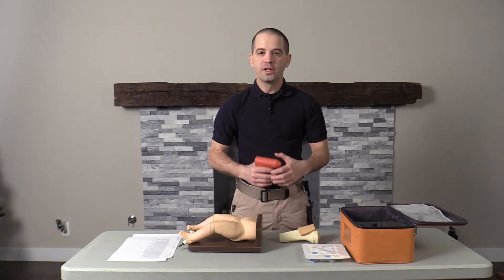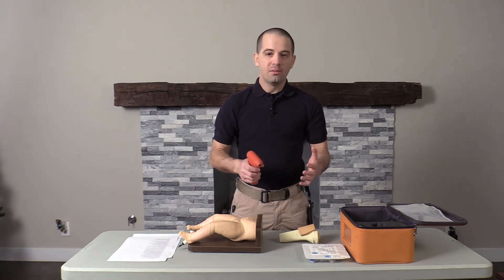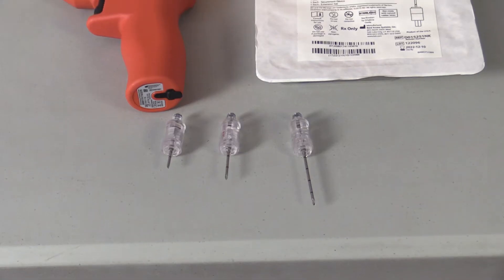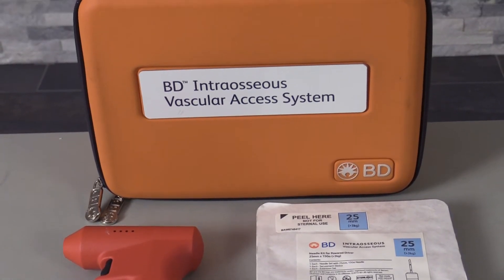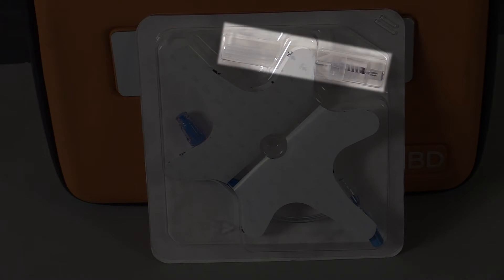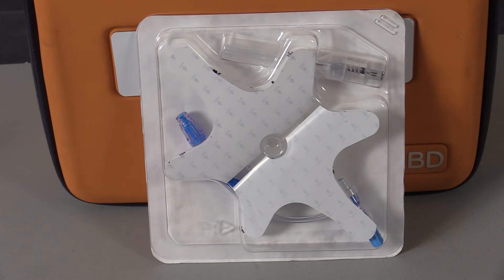Now let's talk about how it performs. Just like all the other drivers in the I.O. market, you're going to have to figure out your needle length. This comes with three different needles, just like the other drivers — you've got your infant, your adult, and your humeral head needle. You will notice that all the needles are the same color. However, on the packaging you'll see the different colors: standard blue, pink, and yellow markings for your needle size. I really like the way the needles come packaged — with your needle, your securing device, and your saline lock all in one. Also, this saline lock has two ports on it for easy medication administration.